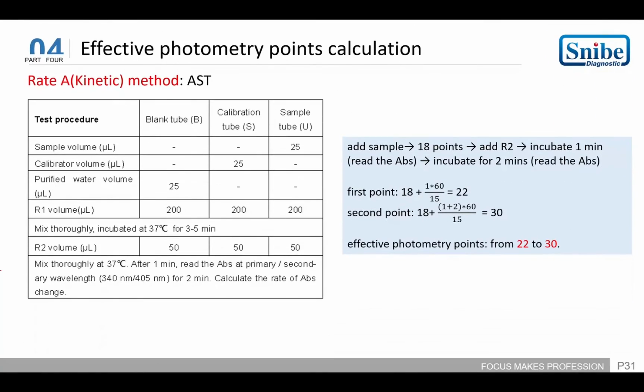The next one is the rate A. Only when we add the reagent does the reaction begin, so we have to pay more attention to this part. After 1 minute, read the absorbance for 2 minutes. So now we have to calculate it.